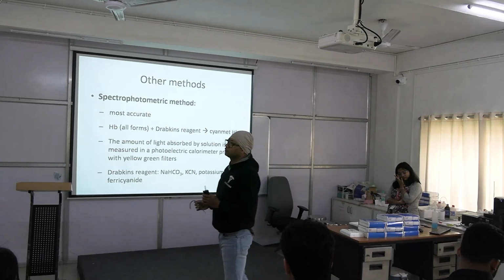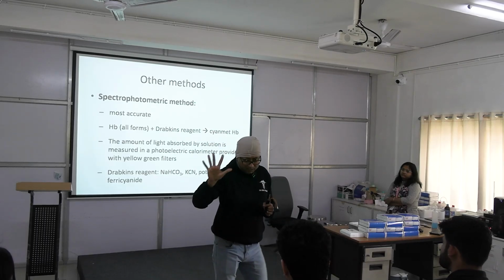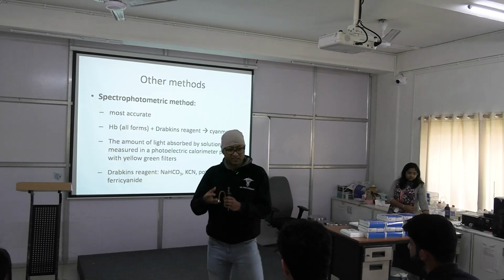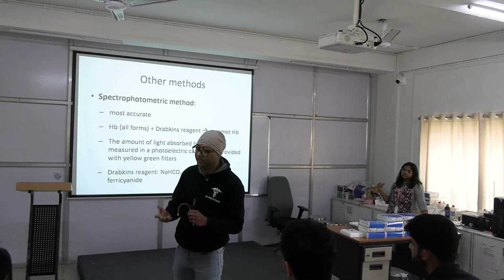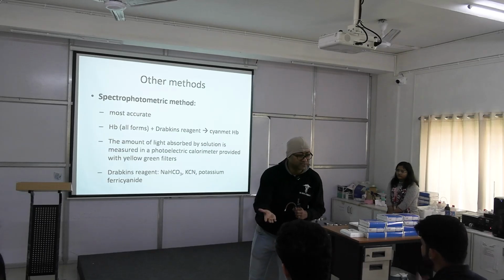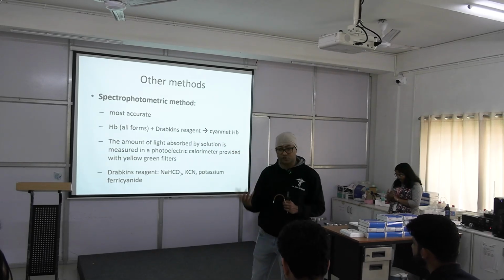Okay, so as you know, for your hematology practical there are 10 marks, 5 marks is for your performance. Okay, and ये जो आप hemoglobin concentration निकालोगे इसका procedure, इसमें 5 marks है, and cross question में 5 marks रहेगा. Okay, cross questions are these. So what are the disadvantages of Sahli's method? What are the advantages of Sahli's method? What is the most accurate method? Right? So these are your cross questions.